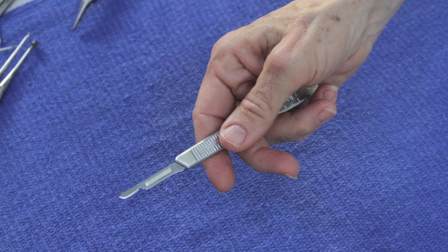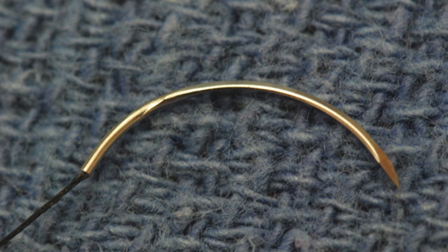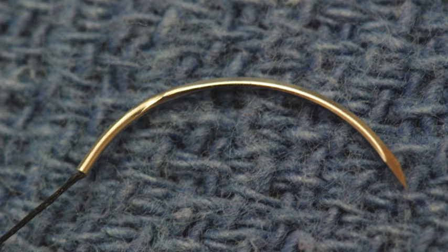Another common surgical instrument that you will be introduced to is the suture needle. In modern medicine, we find that the needle and the thread are connected together. This connection at the end is called the swedge. The swedge is nothing but a hollow tube in the needle where the thread is inserted and then pinched so they form one unit. It is very important when handling a suture needle that you do not damage or injure the swedge area, as this may cause a separation of the suture material. If this should occur, this causes the suture needle to be useless.